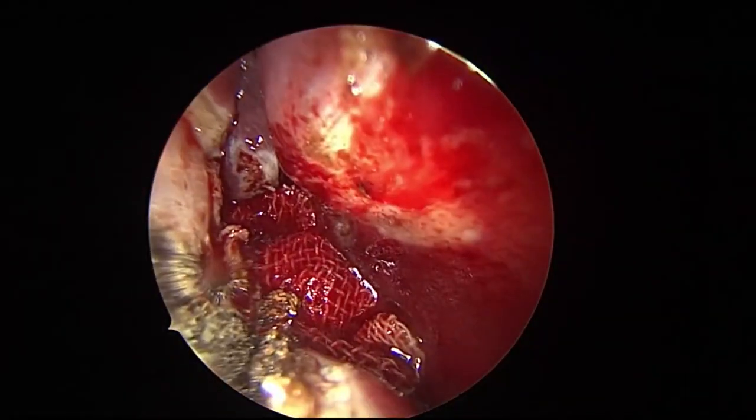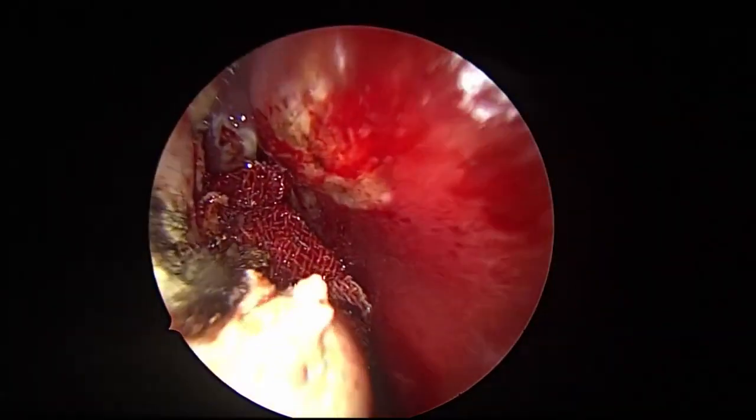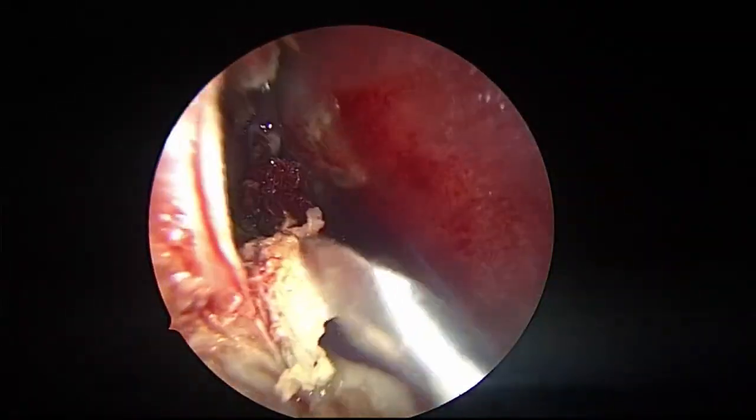See, this was the insulated suction cautery, monopolar. Could you see? Yes, sir. So never run your coagulator over it.